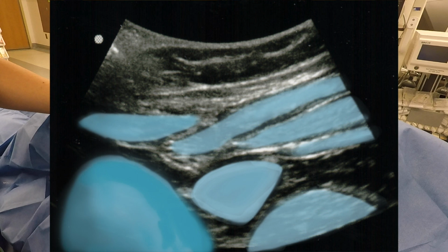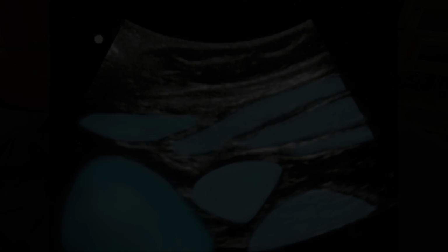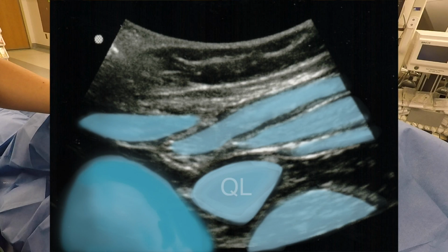Identify the sonoanatomy: subcutaneous tissue, EOM, IOM, which is usually the thickest layer, and the TAM. Below the TAM is the peritoneum, and you may note bowel peristalsis. Follow the EOM posterolaterally until it tapers off. Identify the QL muscle. Advance the needle using an in-plane view in order to maintain constant visualization of your needle and the tip of the needle.